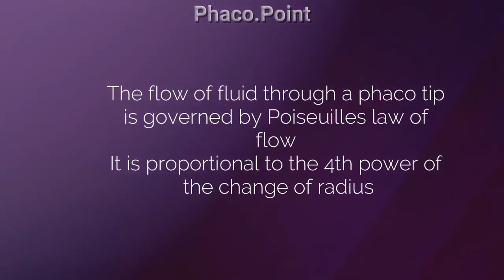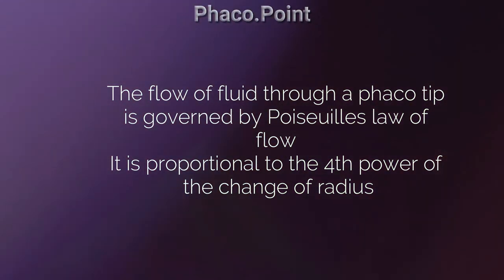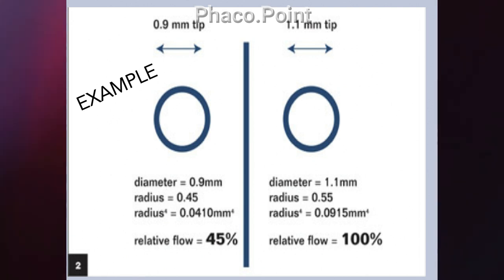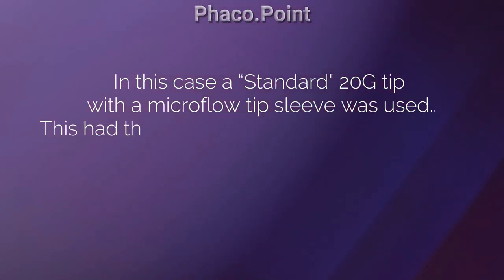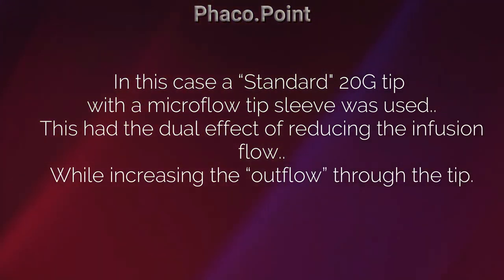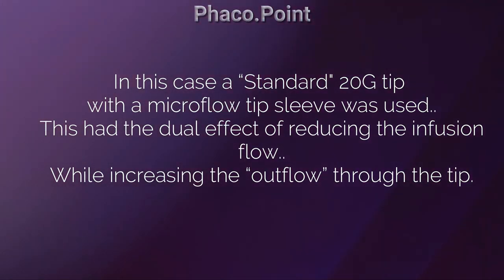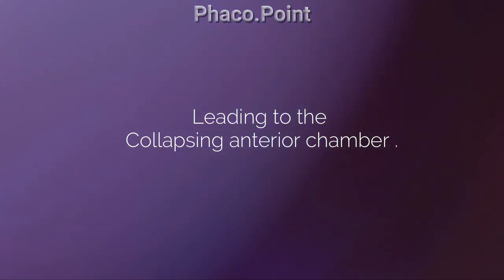Remember that the flow of fluid through a tip is governed by Poiseuille's law, and the flow is proportional to the fourth power of its radius. So just by narrowing the tip from 1.1 to 0.9 millimeters, you reduce the flow by more than 50%. So instead of giving me the microflow tip that we normally use, I was provided with a 20 gauge standard tip with the microflow sleeve. This had the dual effect of reducing infusion flow while also at the same time increasing the outflow through the tip, and this was the main cause for the collapse in the anterior chamber.